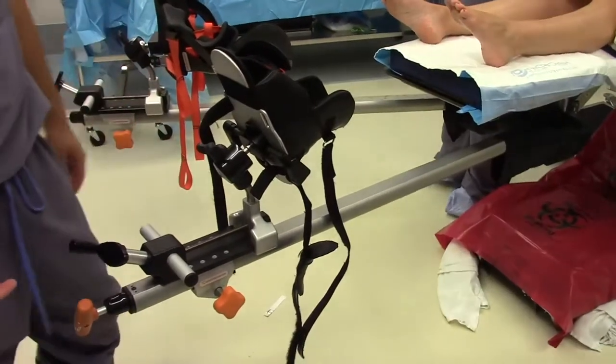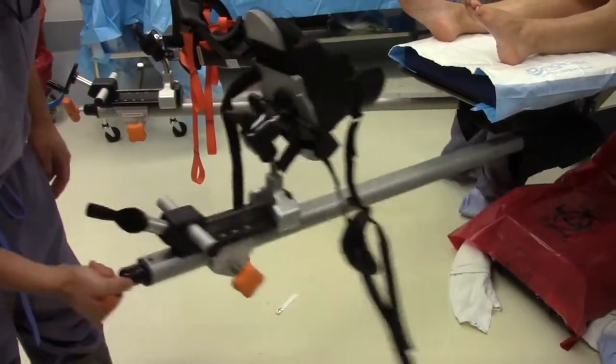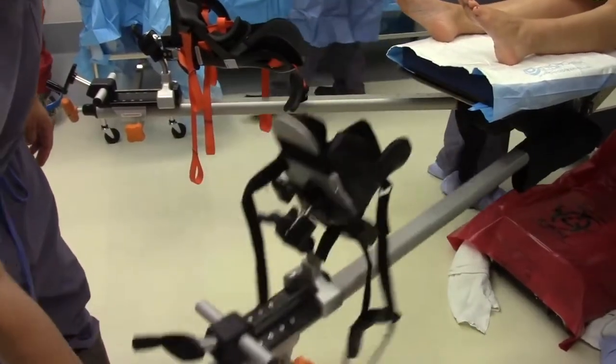At the end of the leg is an orange knob which will unlock the entire leg when turned 90 degrees, allowing you to position the leg for surgery.